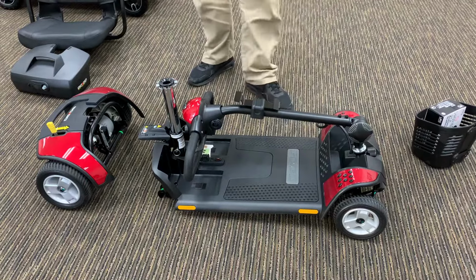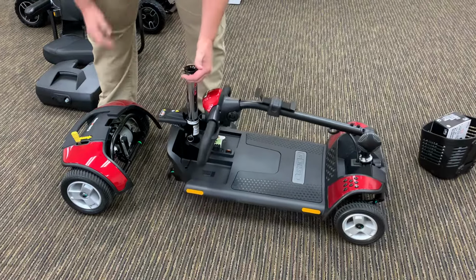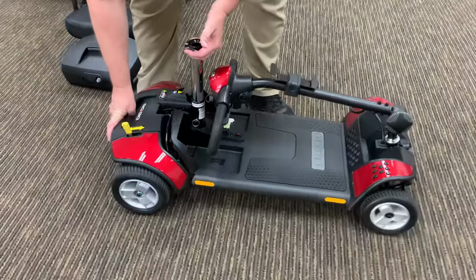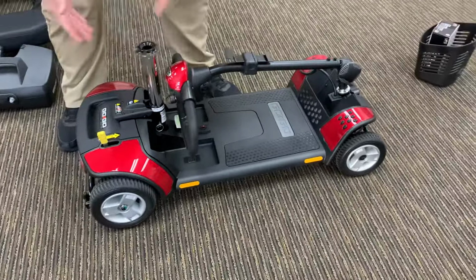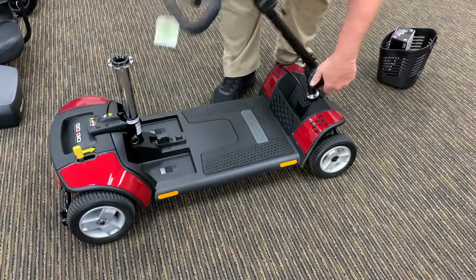Now to reassemble it, you just pick this up right here, the seat post. You want to line it up with these green lines here. If you line it up correctly, it falls right in place. You bring this back up.